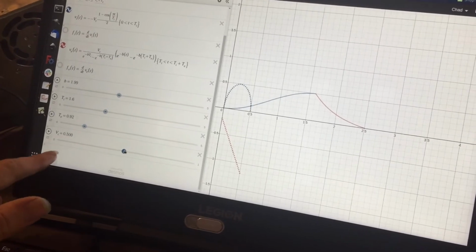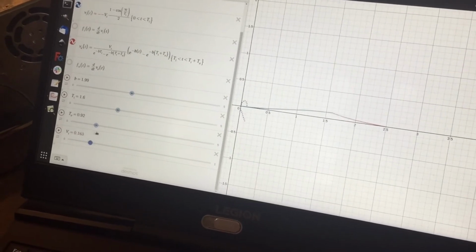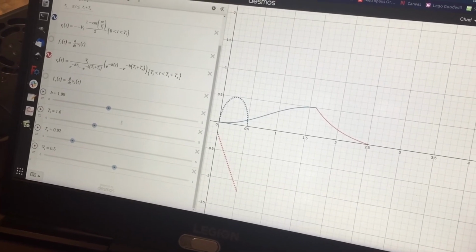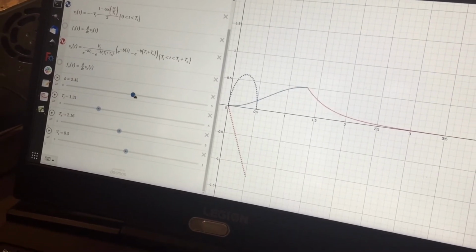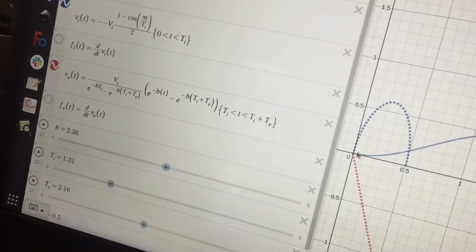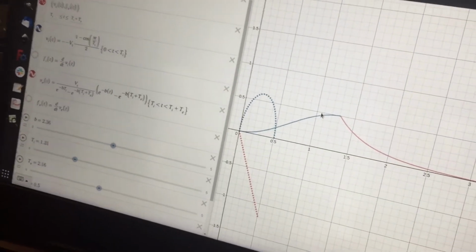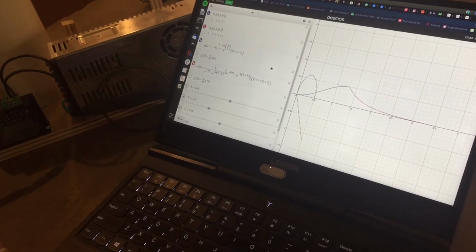And then this is the tidal volume, which is essentially the max volume of the breath, and it's pretty common for it to be half a liter. So I can put any of these values where I think would be natural for breathing, and then I'll just take these values, plug them into my equation, and I'll get a model for how the flow rates and the position of the motor should be in order to get my flow loop the way I want it.